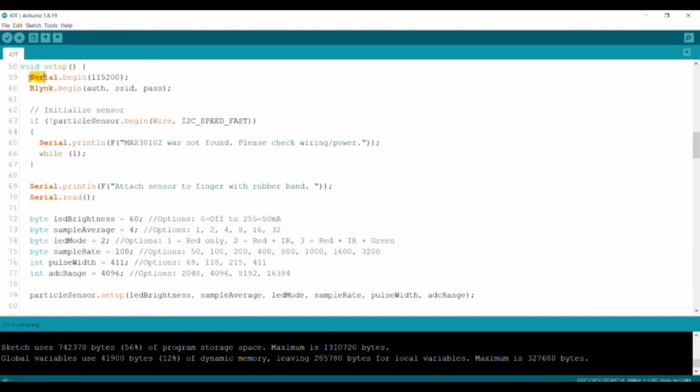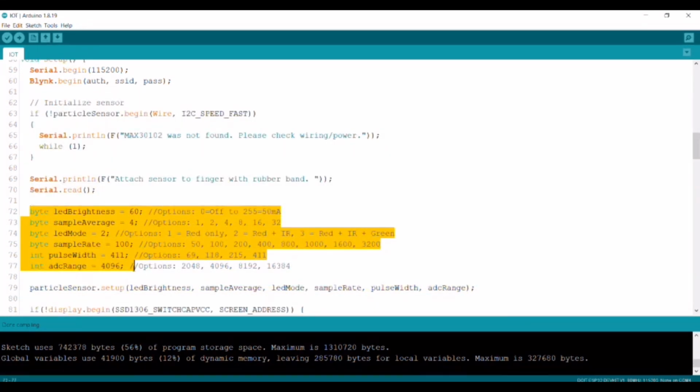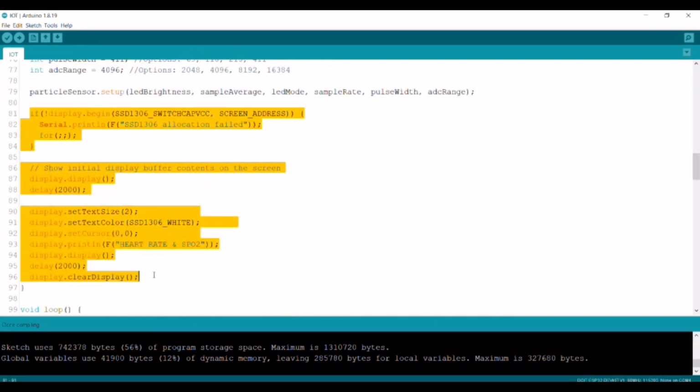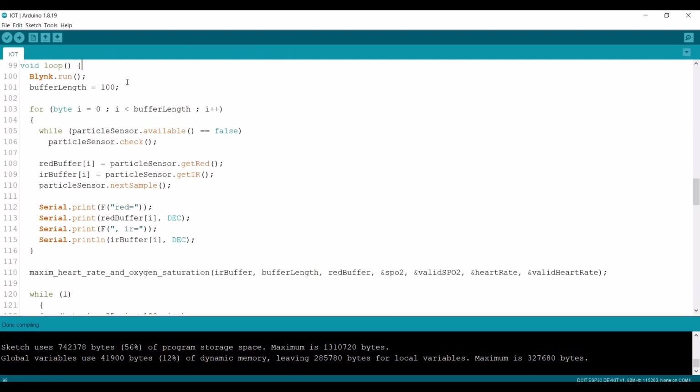And for the void setup, I start with Serial.begin. This one is for checking the serial monitor, and begin the Blynk. This one is to set up the MAX sensor according to these values, and this one is for the OLED device. I need to show this message or this topic on the OLED. Before we go further to the loop, we will clear the display first. In the loop, we start with the Blynk. I will set it to run, and the buffer length equal to 100 samples, read the first 100 samples, and determine the signal range.